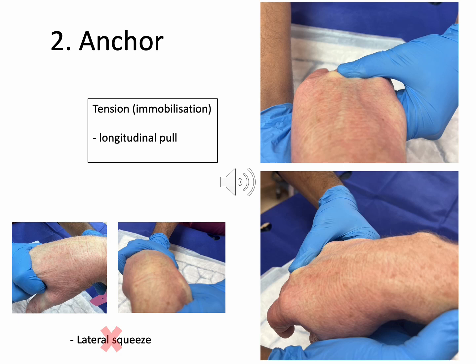Immobilizing or fixing the vein prior to trying to insert your cannula is important. As you can see from this slide, longitudinal immobilization through the application of tension is the best way. This results in the least collapse of the vein.